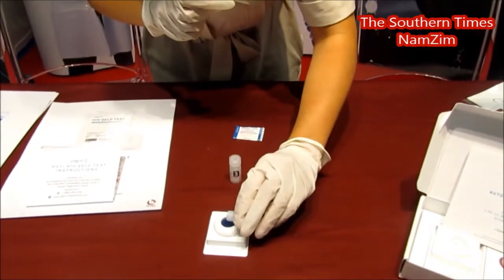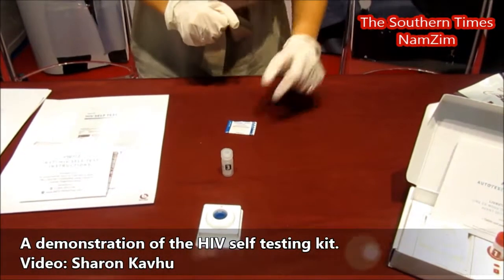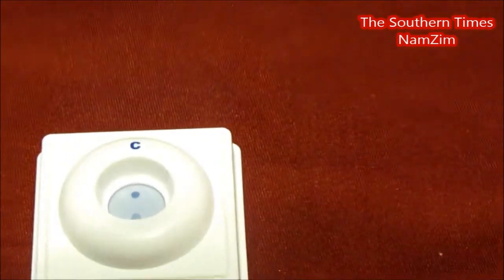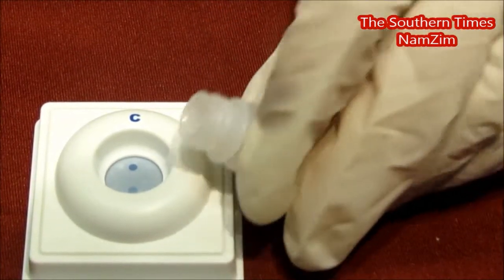So you add bottle two. And you can actually start seeing the result right away after bottle two. What bottle three will do is a clarifying solution and actually starts wiping out that blue background so you can get a clear, accurate result.